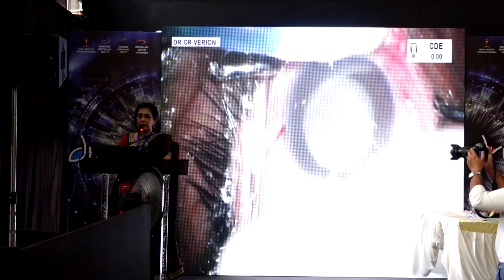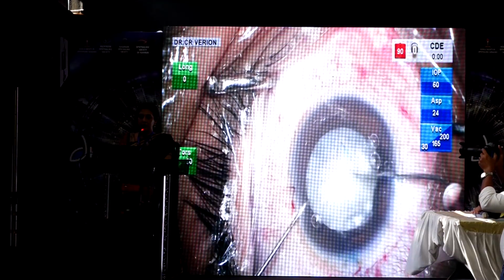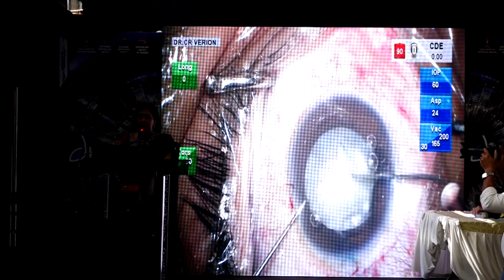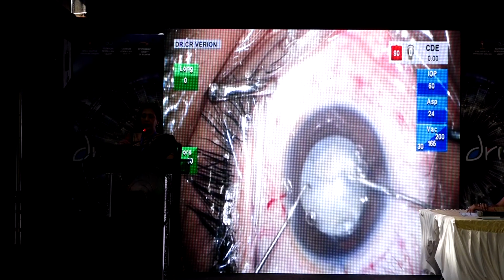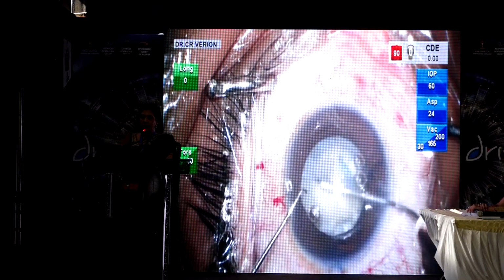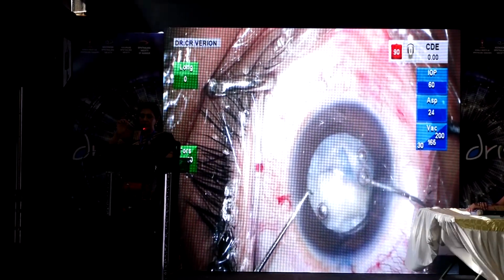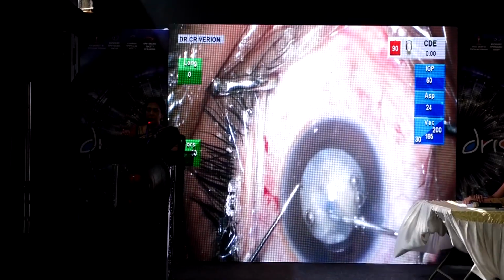Now this is a significantly hard white cataract, and it looks as if the rhexis is quite fibrous. Sometimes in very dense fibrosis, a femtolaser passage is not very comfortable, but this fibrosis was not that intense. The only thing is, you cannot just bunch it up and lift it, it's not free floating, so you need to use a cystitome to remove it.